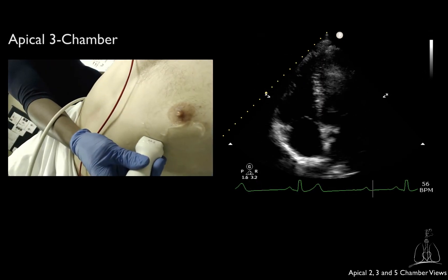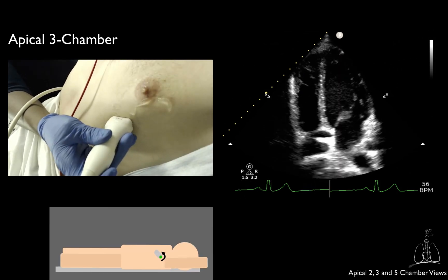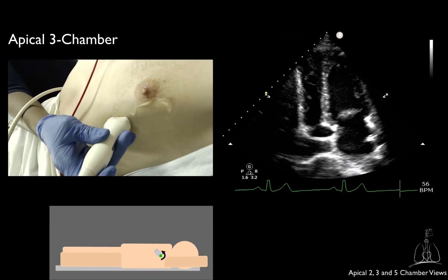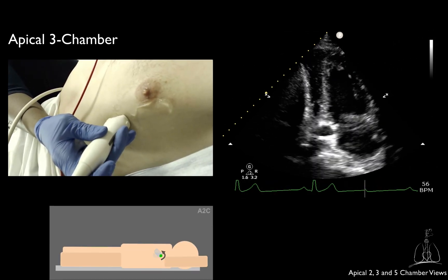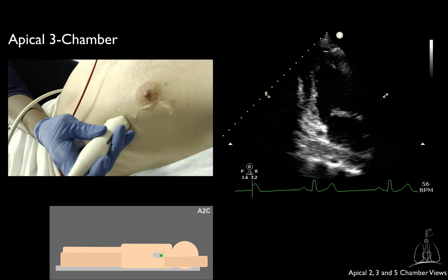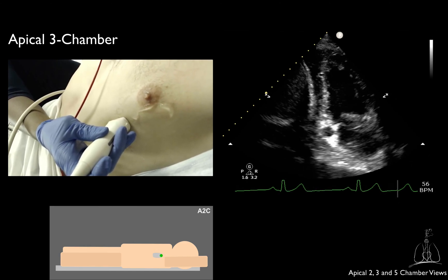To obtain the apical 3 chamber, continue rotating counterclockwise from the apical 2 chamber. The marker should be pointing towards the right shoulder.